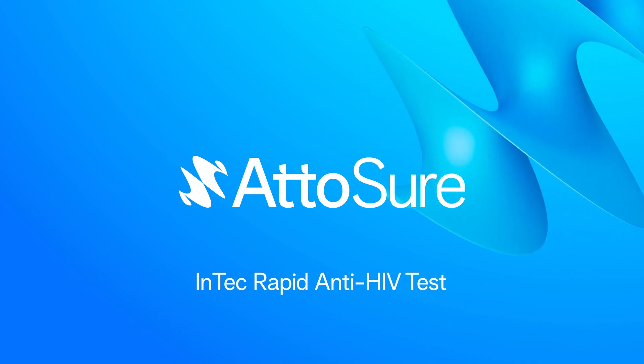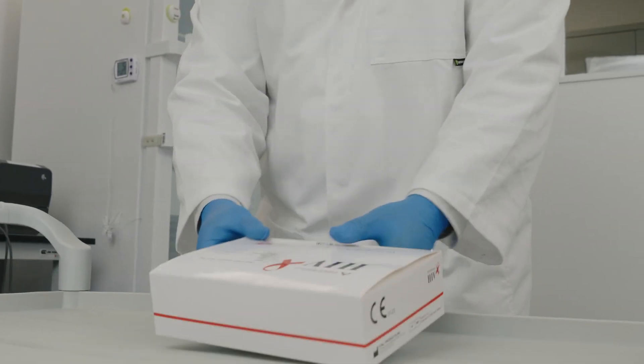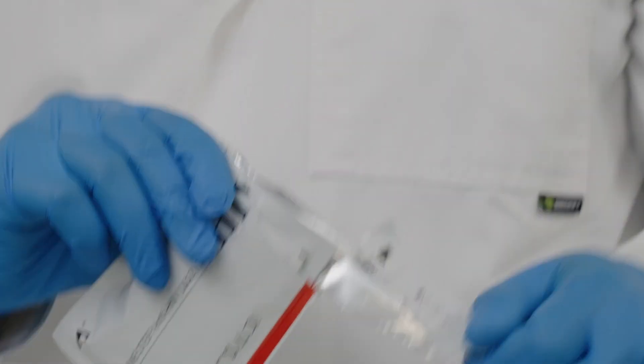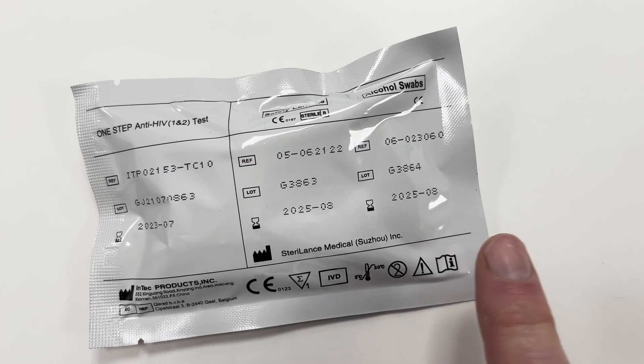How to use the INTECH HIV antibody test. Check the test expiry date.